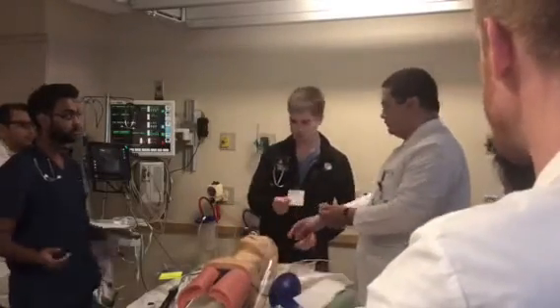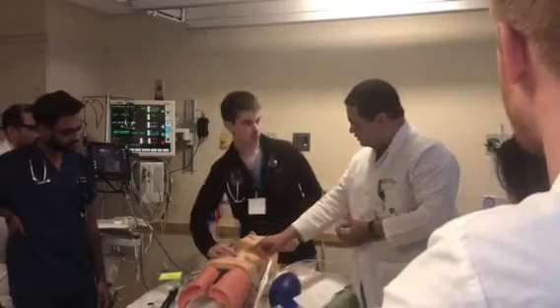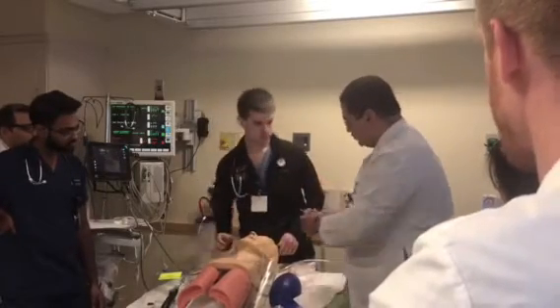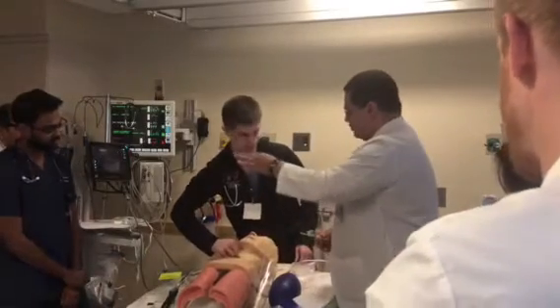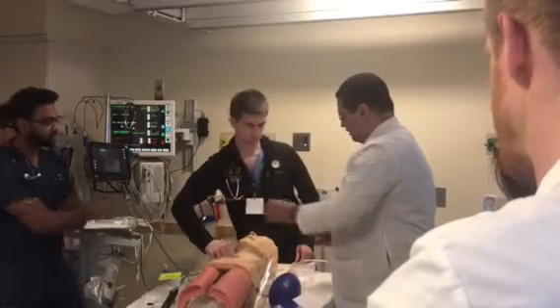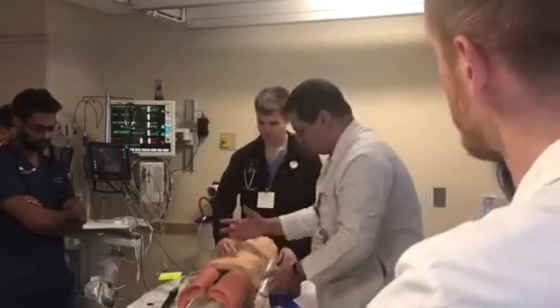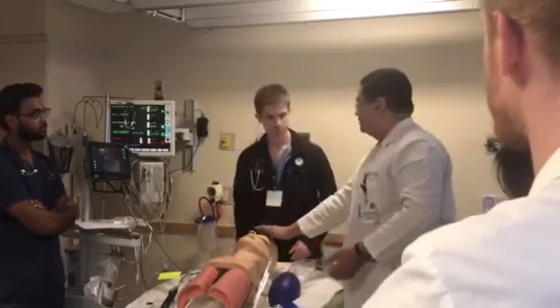All right. So he's gonna give some lidocaine. Where? Show me what you're gonna do. So the prominence is right there. So just below it. Right? So you're gonna put your 2 fingers here, and then you're gonna go down until you feel a depression. Yeah. But meet the 2 fingers first. Right? Go down until you feel a depression. Yeah, right there. So now we're gonna give you a small needle for the lidocaine, and you just numb it here. Assure the patient you're doing fine.